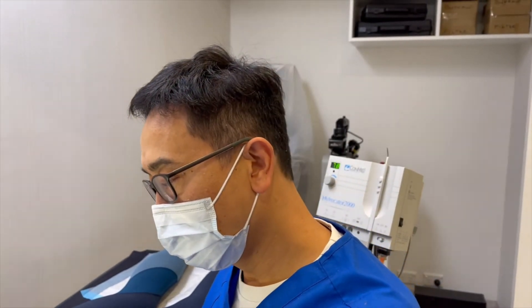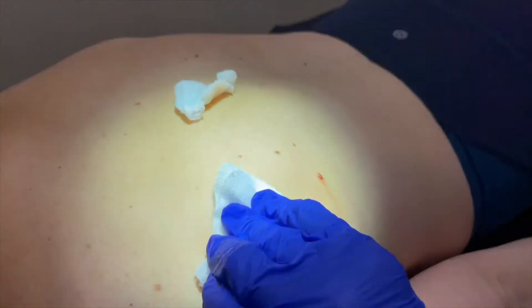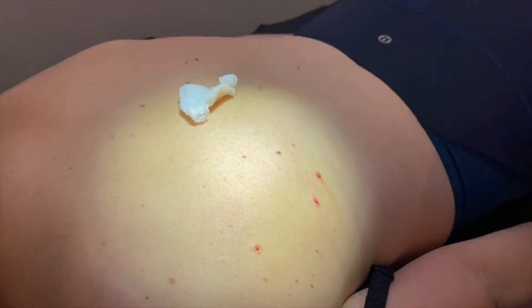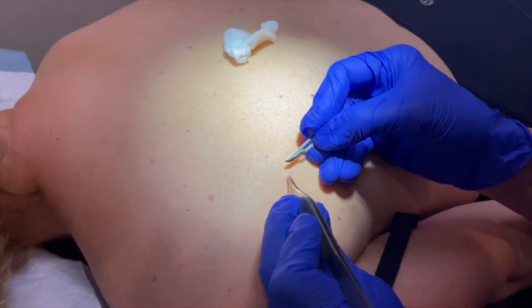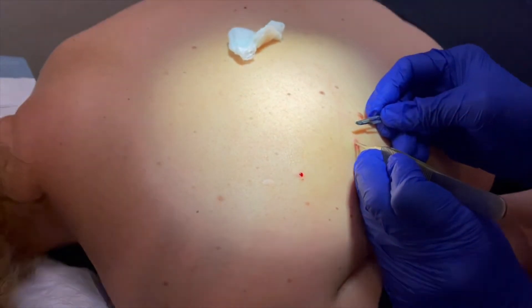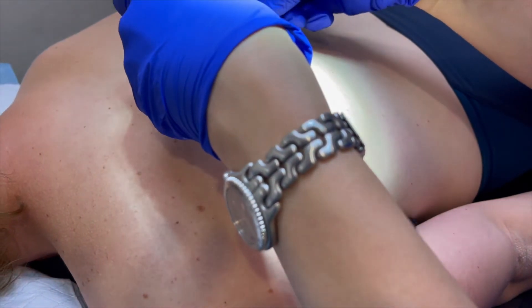We're just going to be doing a shave excision and electro-desiccation of two raised intradermal naevi — two moles — and a seborrheic wart. The first part is anesthetized with local anesthesia. Just a little pinch. Do you feel anything? No.